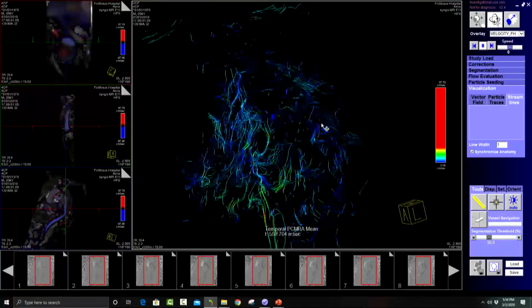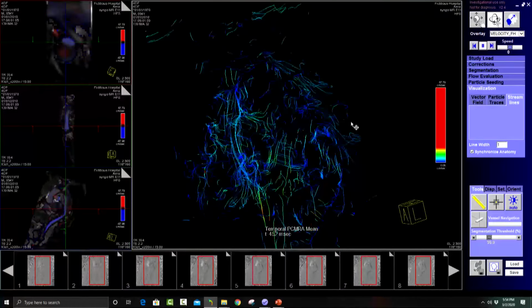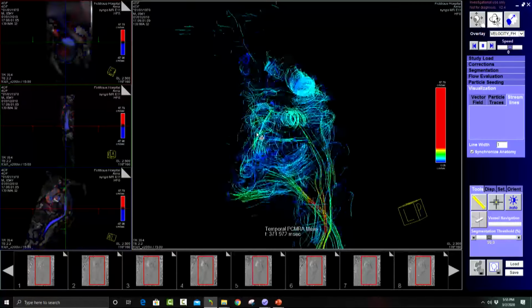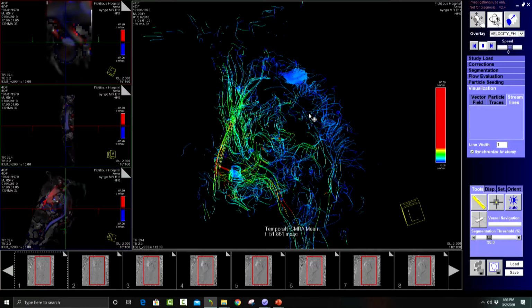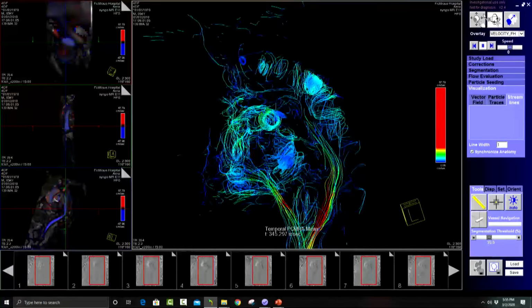It's definitely a nice picture, but in addition, this takes roughly 15 minutes to acquire. It takes time, like in MR. So when you order it, you have to ask for 4D flow. We've got it set up here. It's a question of whether the patient can tolerate it, and how long the patient has been in the scanner. But if the patient's doing okay, they'll add this onto the back end of the study. You're not going to get it automatically; you have to talk specifically about getting 4D flow. And how much longer does it take? About 15 minutes.